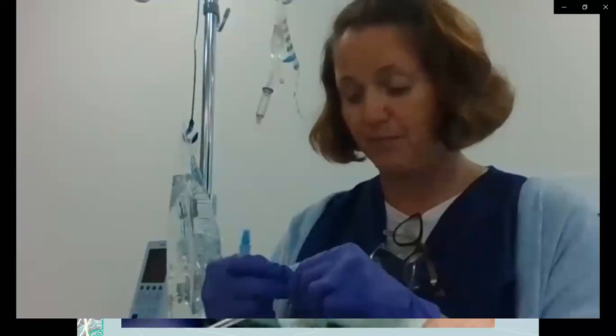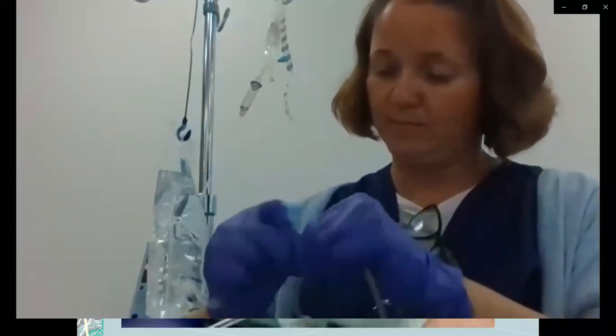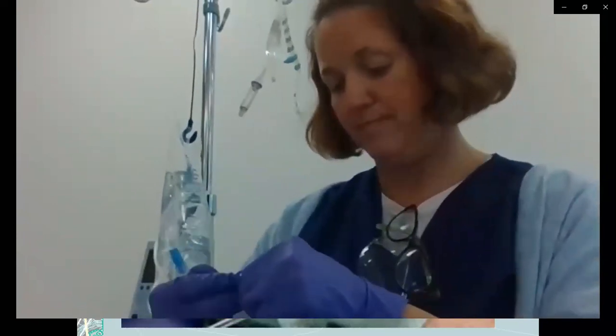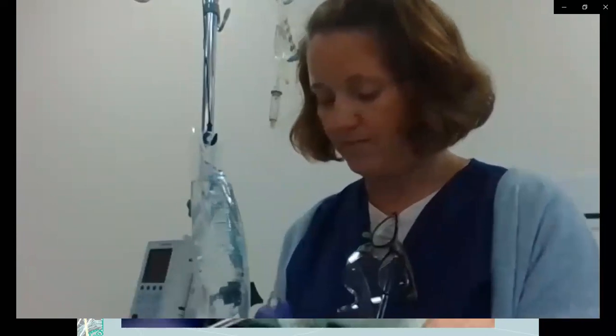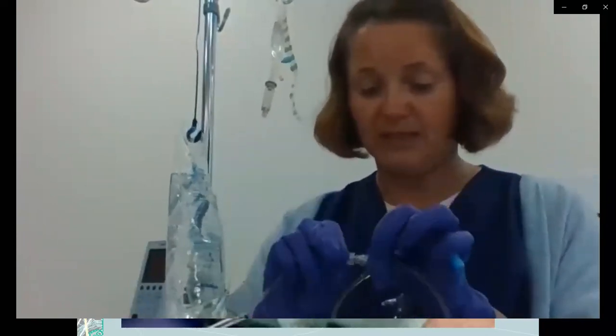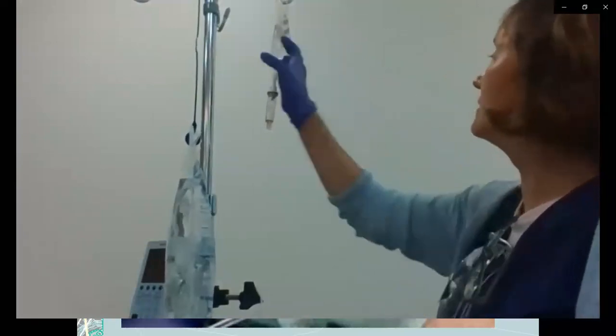We're going to scrub our hub. Aseptically connect these lines. All right. So we are now going to backflush this line.